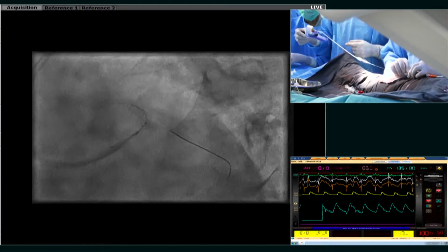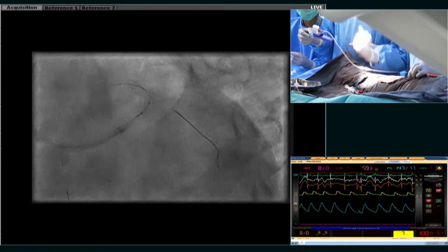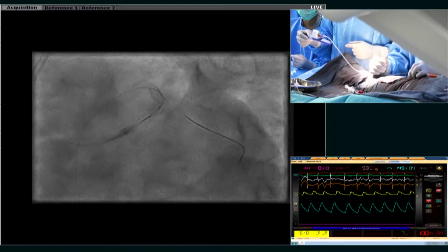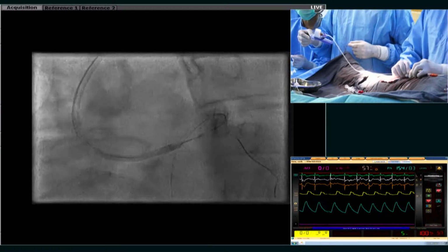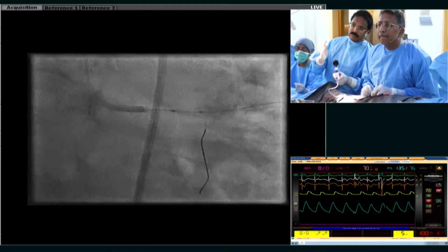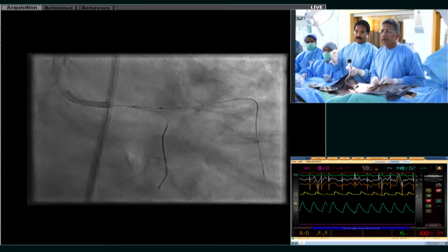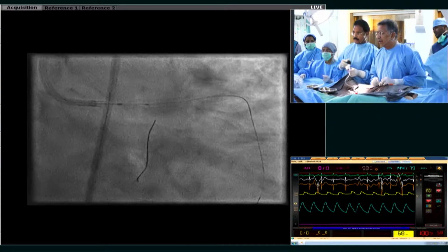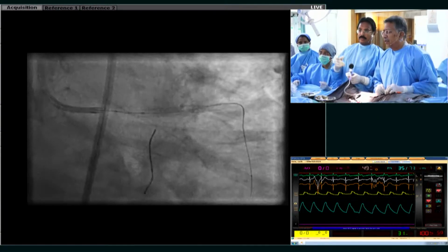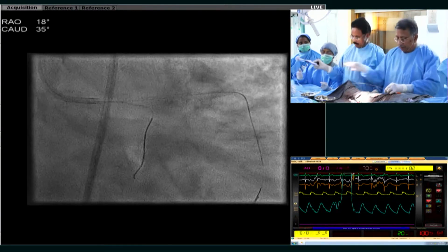Angio stent view to see if we have reached the proximal part of the stent in the left main. Get me an RAO caudal view. I want to check if we have touched the proximal part of the stent in the left main. Our marker was exactly at the origin of the stent. Are we sure about that? With a little overhang also below. Let me do a clear stent, we'll see. Right, perfect, good.